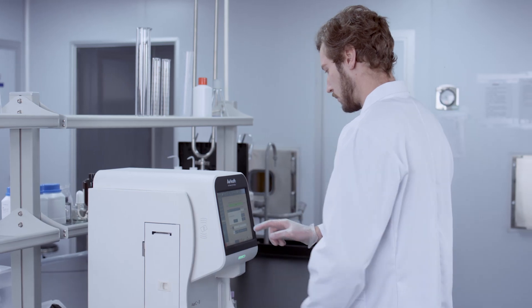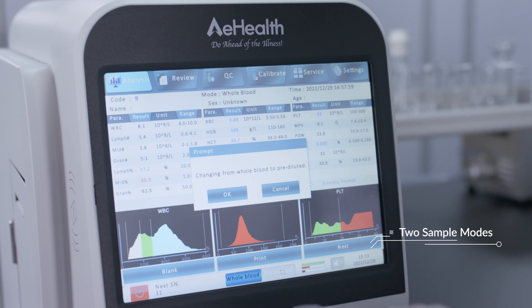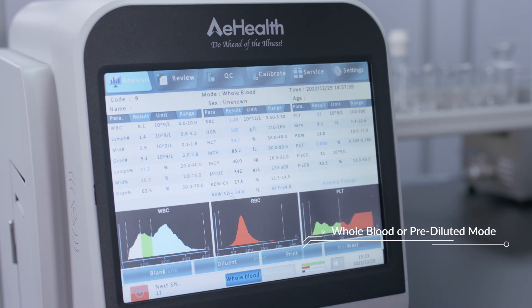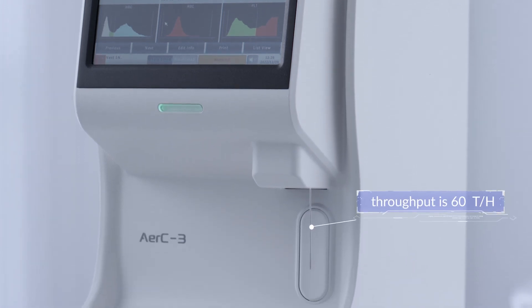The AerC-3 has two sample modes — whole-blood mode and pre-diluted mode — each distinguished by two colors to avoid misoperation. Throughput is 60 tests per hour.